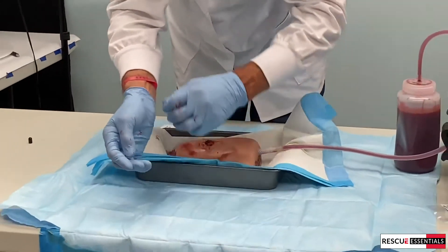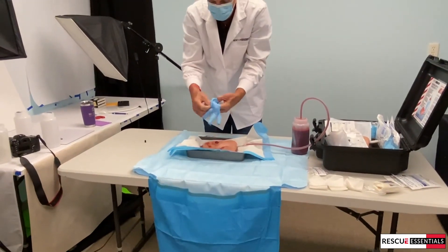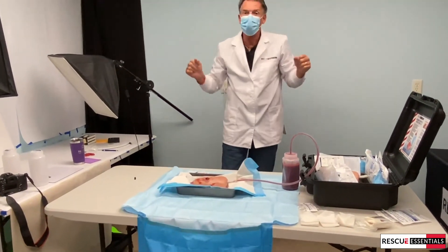So I just drop that in there, peel my gloves inside out, take those, drop it in, and it's time for the next student.